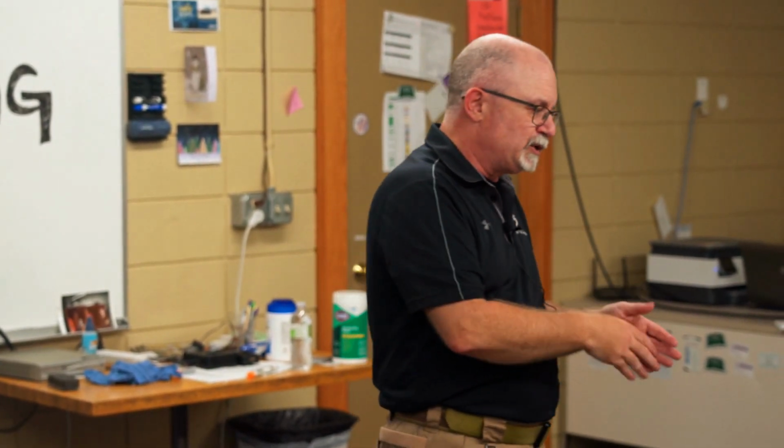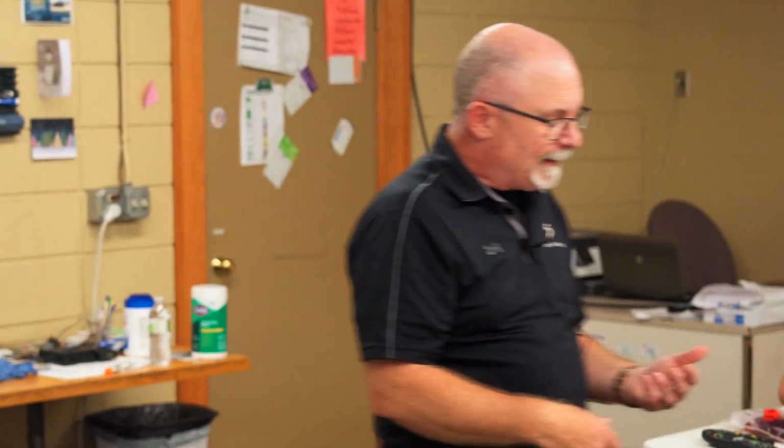In EMS, generally 22 to 18 is kind of the range. So 18, 20, and 22s are pretty common. 16s we do carry at Dodge, but we just don't use them. We don't need that much volume. An 18 gets plenty in there.